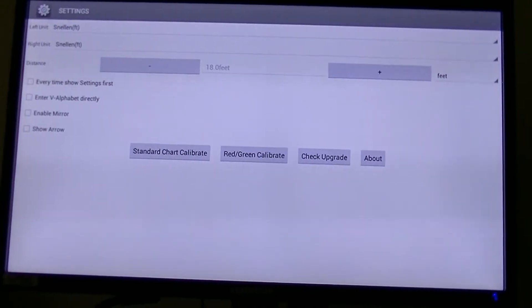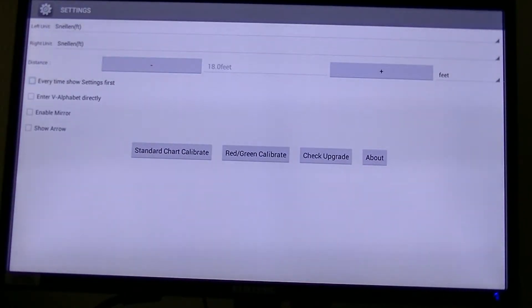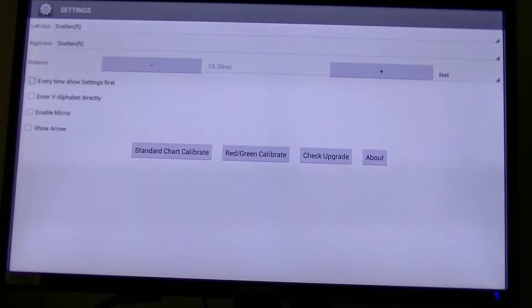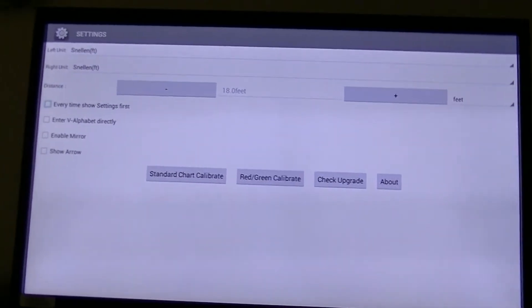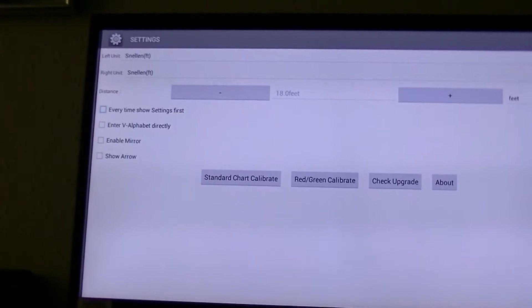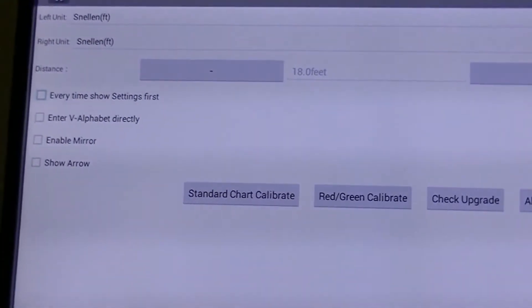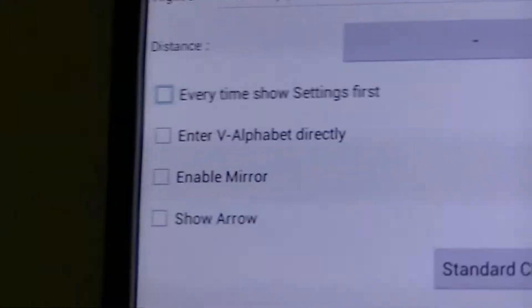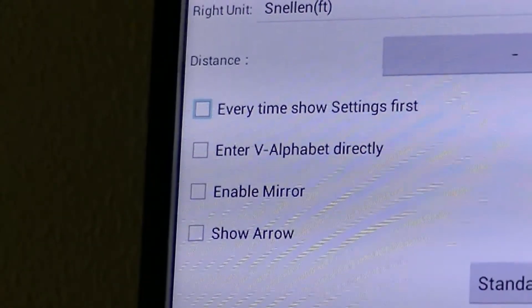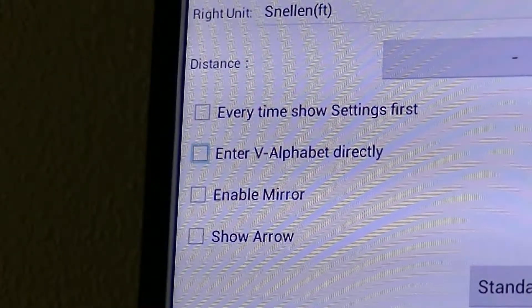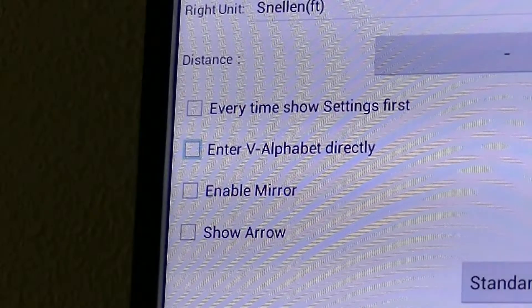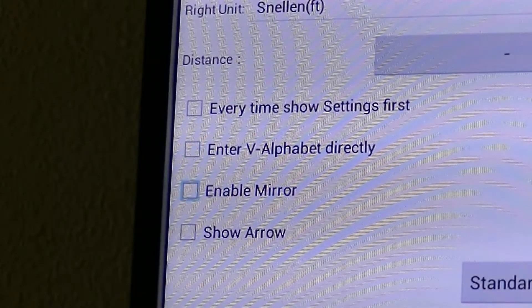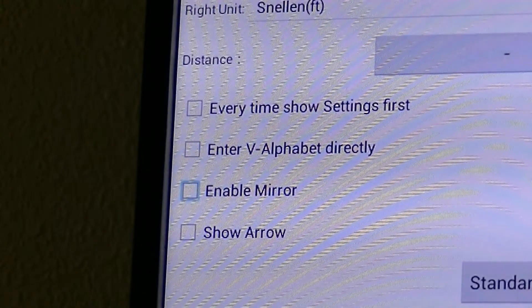And down here, if I scroll down — every time show settings first, enter V alphabet directly, enable mirror. So if you're using a mirror system, that has to be checked.